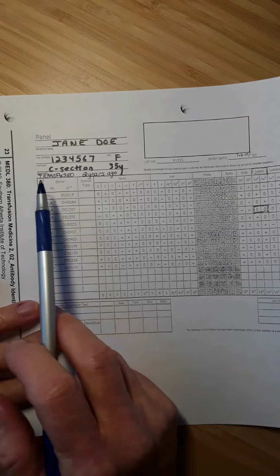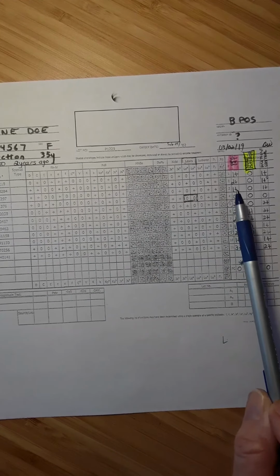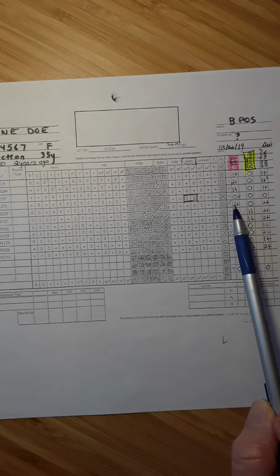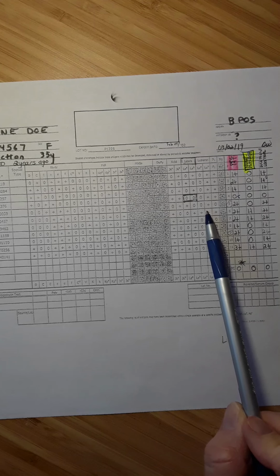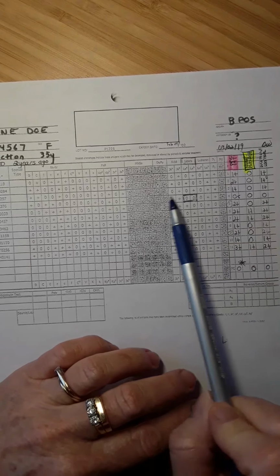If they're just Lewis antibodies, you will learn as you work through the module, Lewis antibodies are really not something that causes hemolytic disease as a newborn. These antibodies are not involved in hemolytic transfusion reactions. So Lewis antibodies are a pain in the butt, but they're not clinically significant typically. So let's get rid of them. Let's go with the hunch and get rid of the Lewis antibodies.